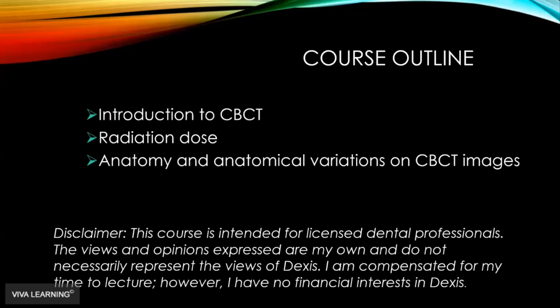So here's the course outline. We're going to talk a little bit about CBCT, an introduction to the fundamentals. We'll talk about radiation dose and compare it to some other imaging modalities. And then we'll look at some anatomy and anatomical variations.